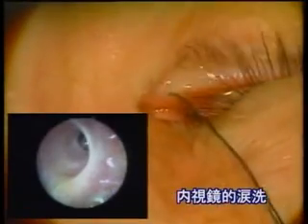This is an endoscopic irrigation 436 days postoperatively. Fluid is flowing from the new large opening. This is an endoscopic irrigation for the natural opening. Thank you.